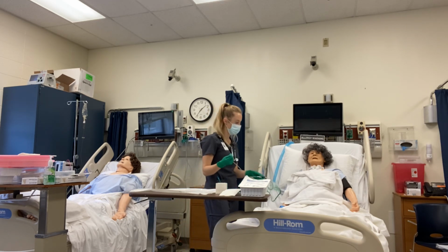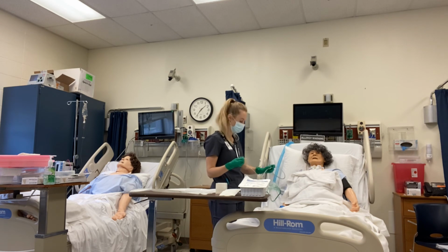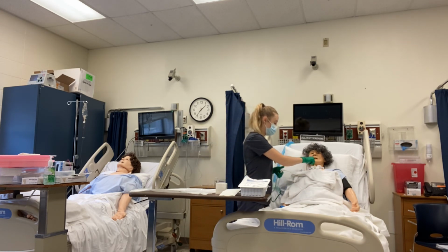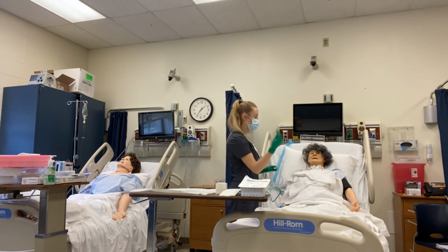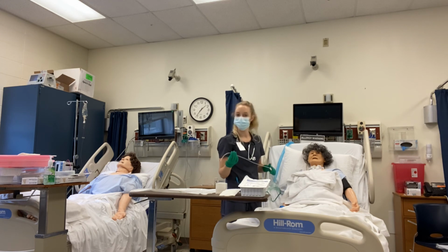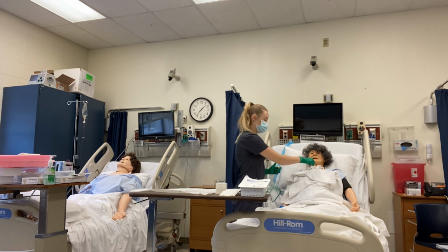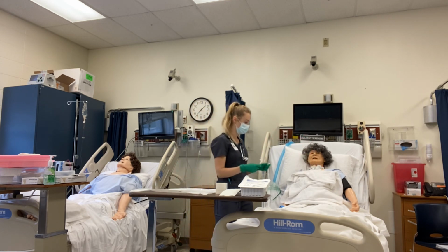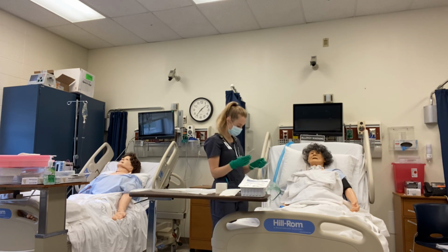And then I'm going to do a few passes. Going in, and then applying suction on the way out, allowing Mrs. Jones about 30 seconds to breathe. Applying suction. And applying suction. Assuming at this point that her secretions are cleared, I will shut off the suction.